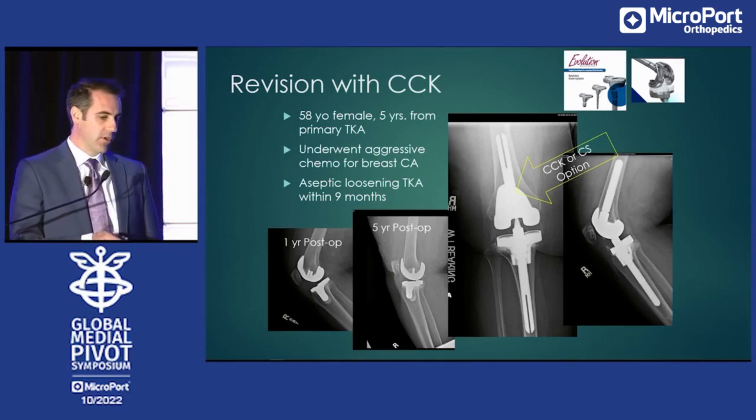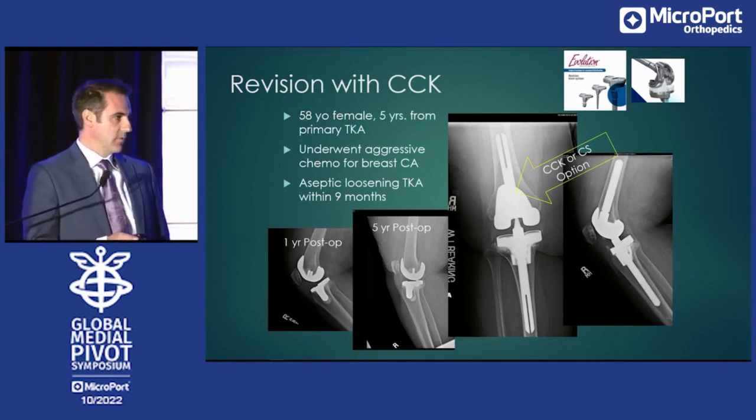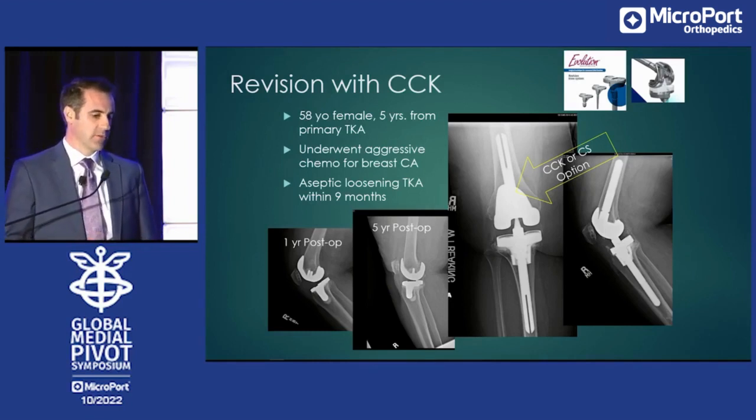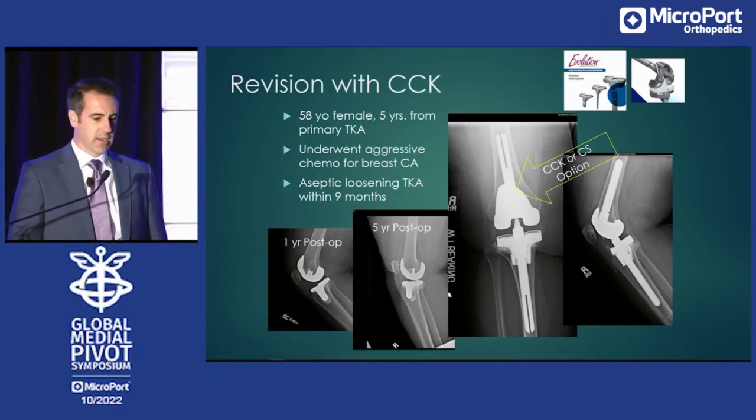This one I have a cone in, you'll notice, and we'll talk about that a little bit in a minute, but you can use cones with these implants without difficulty, and there's a few tips and tricks about that. She also had some augments added to the tibia, and this one I think we could have done a CS femoral option as opposed to the CCK, so you do have some good variability for what you want to do based on your preference or what the patient desires.